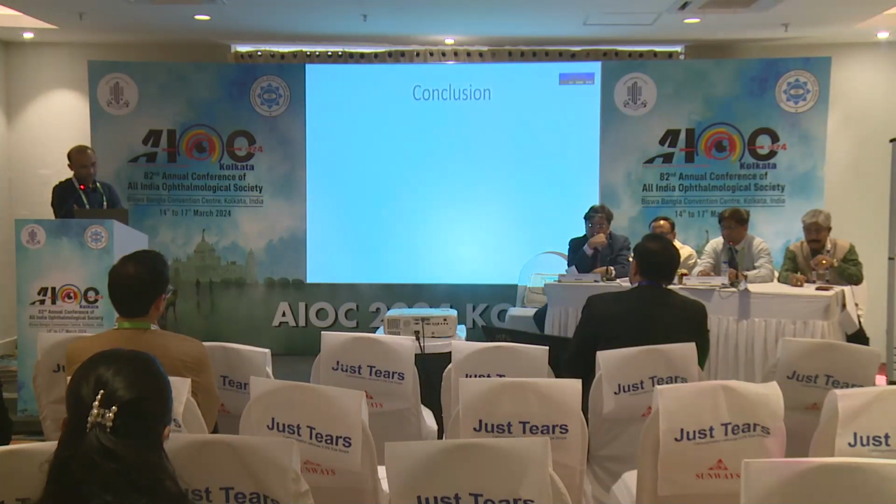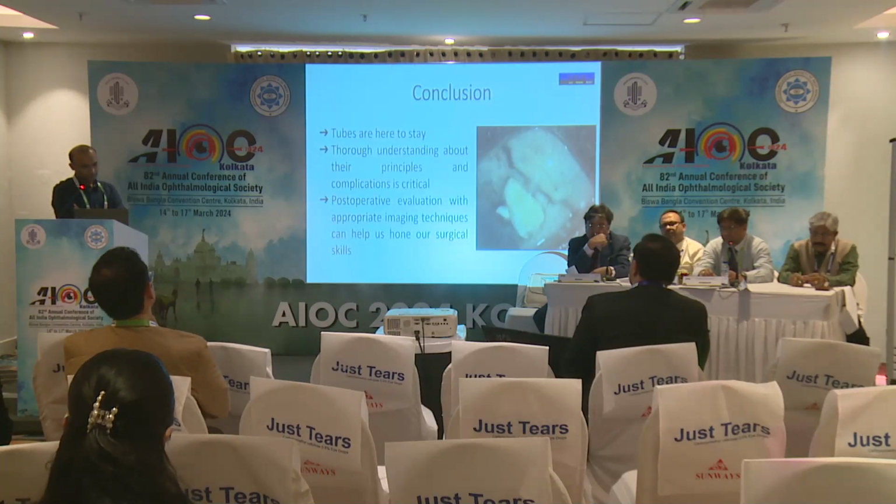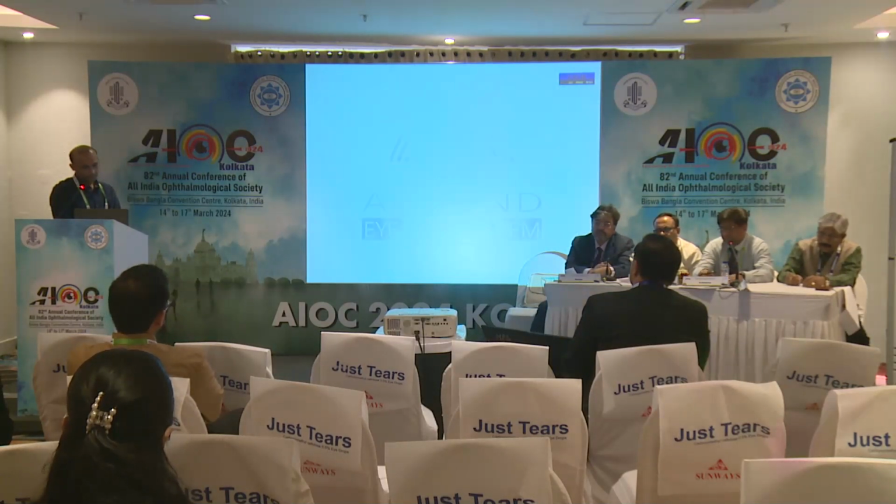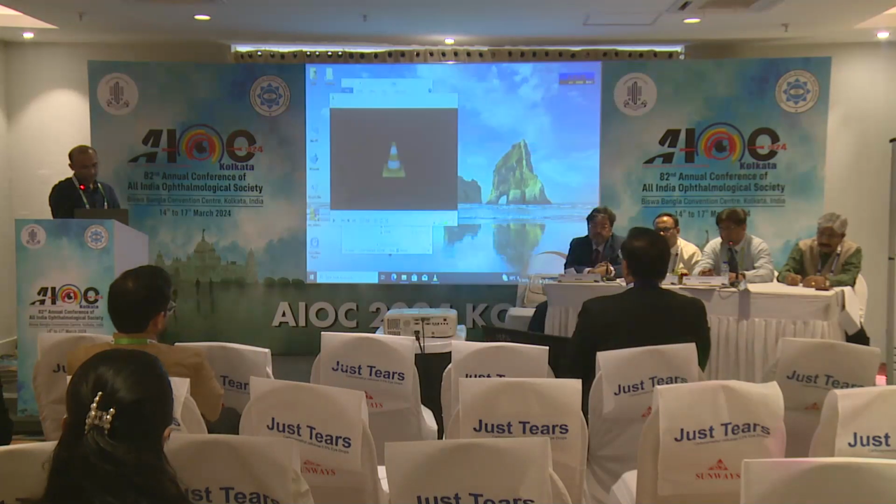Careful case selection and meticulous attention to the surgical details can help mitigate complications after GDDs. Imaging techniques can improve our understanding and help us better manage our patients.